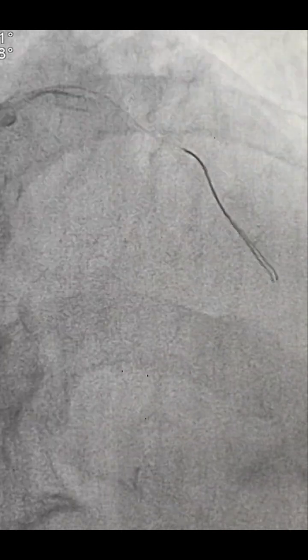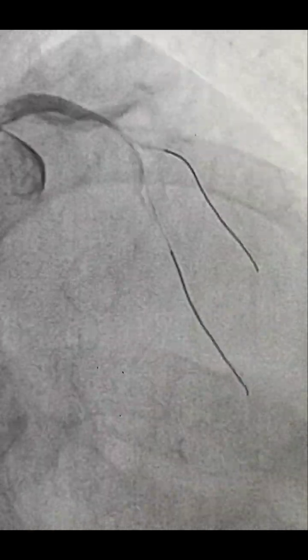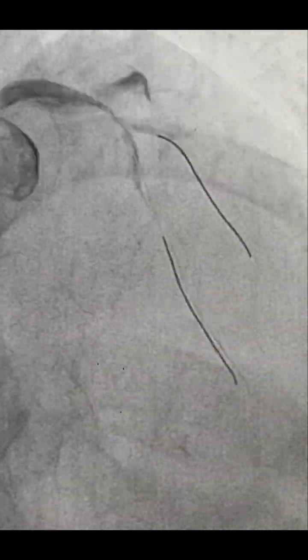So with the right radial route, we proceeded for the angioplasty, and this is the BMW PTCA wire. The catheter was XB3, and firstly the wire directly went to this diagonal. You can see the ostium of the diagonal. So you can see I was trying to push the wire in the LAD. You can see there is a sort of dual LAD structure.